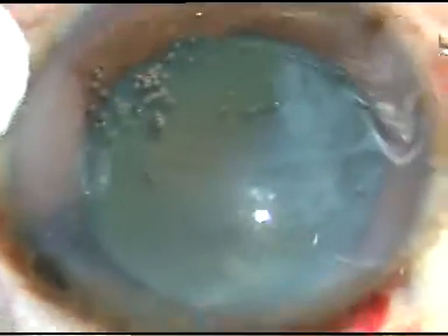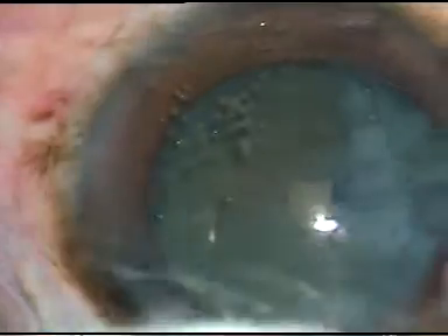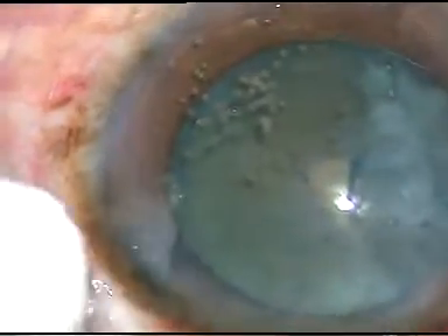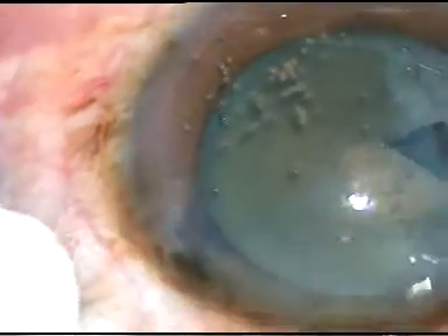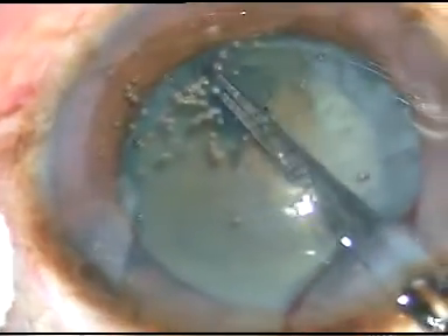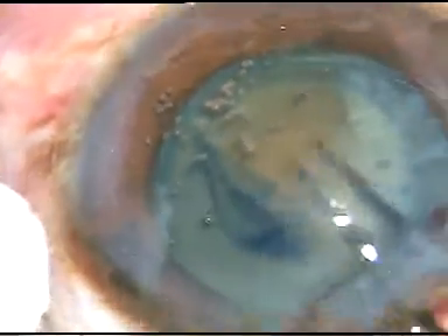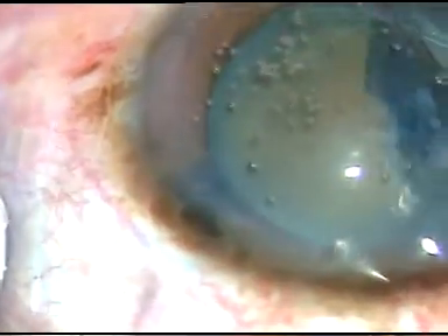Now, capsulorhexis is to be done. I incise the capsule with a 26-gauge bent cystitome, and a flap is raised. We can see there is no milky fluid coming out in this case, so the cataract is not intumescent. I go anticlockwise and make an optimum-sized capsulorhexis.